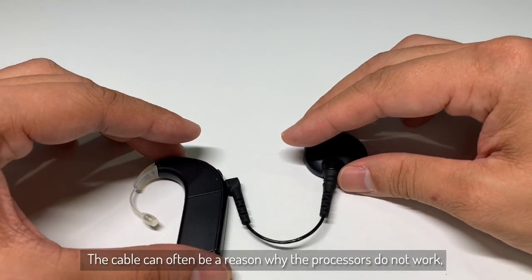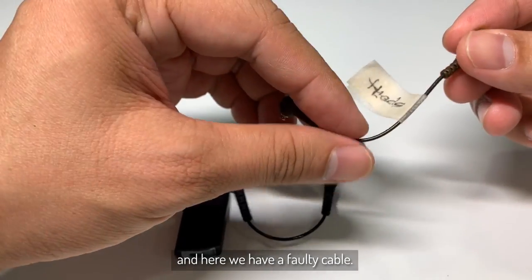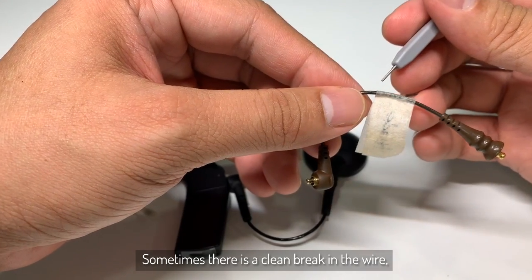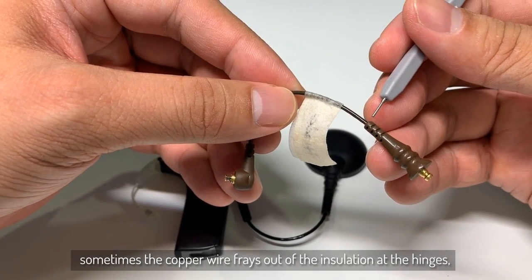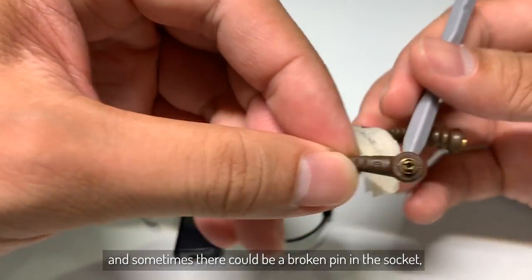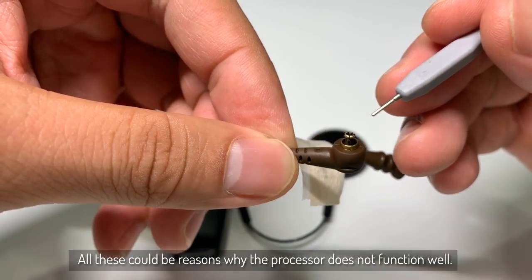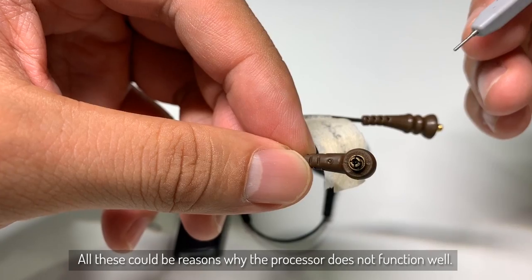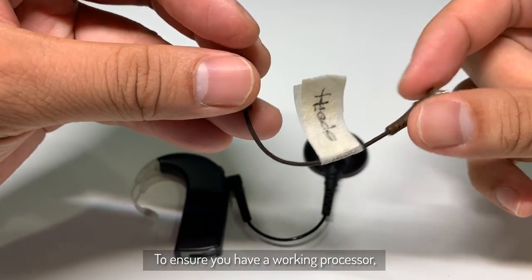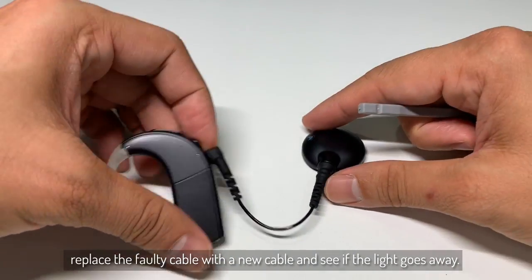The cable can often be a reason why the implants do not work. And here we have a faulty cable. How do you tell physically if a cable is faulty? Sometimes there is a clean break in the wire. Sometimes the copper wire frays out of the insulation at the hinges. And sometimes there could be a broken pin in the socket or corrosion in the socket — all these could be reasons why the processor does not function well. To ensure that you have a working cable, replace this faulty cable with a functioning cable and see if the light goes away.